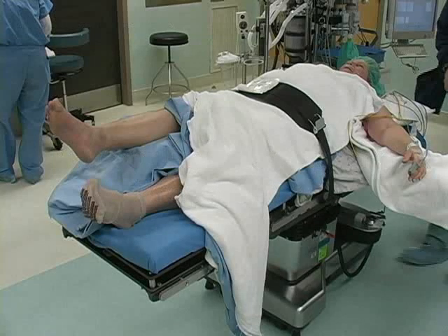The ankle block requires at least three separate needle insertion sites and commonly can involve more. Therefore, it is important to sedate the patient prior to the procedure to ensure comfort. This patient requested light sedation, so you can see her foot move slightly during needle insertion.